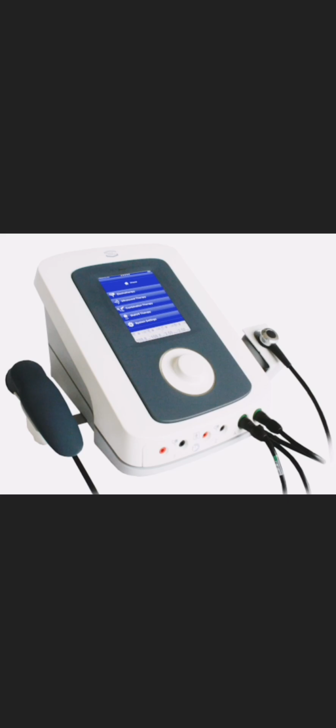Principle of US production. Piezoelectricity is a natural phenomenon found in many materials such as natural quartz crystal or synthetic barium titanate. Direct piezoelectric effect: creation of an electrical voltage across the crystal as it is compressed or expanded. Reverse piezoelectric effect: when a high-frequency alternating current is applied to the crystal, it causes alternate compression and expansion each time the current changes from positive to negative. This produces mechanical sound.